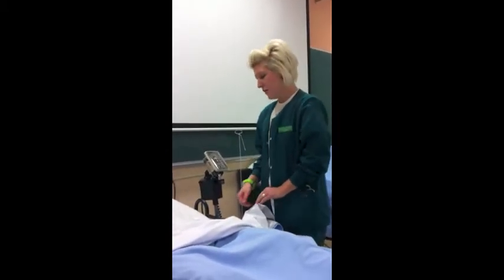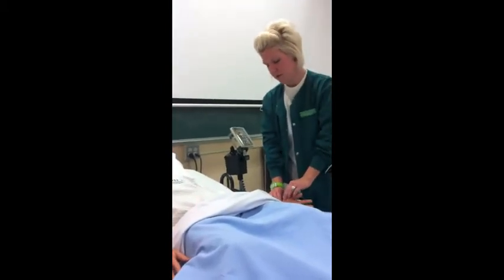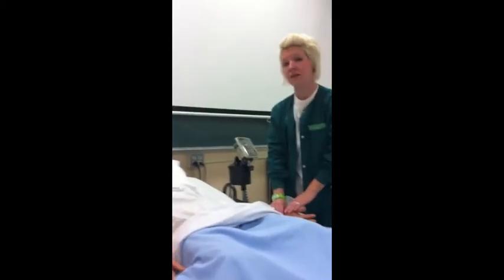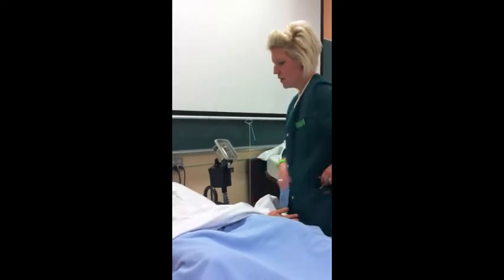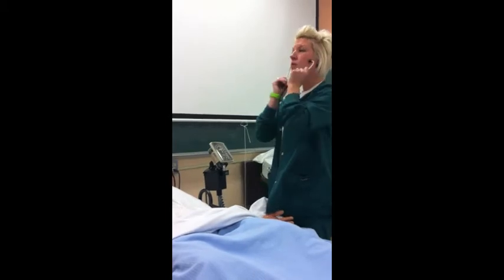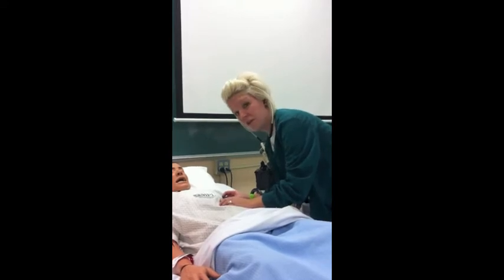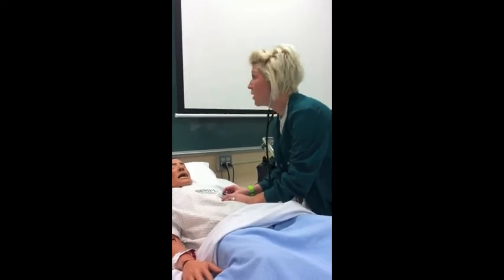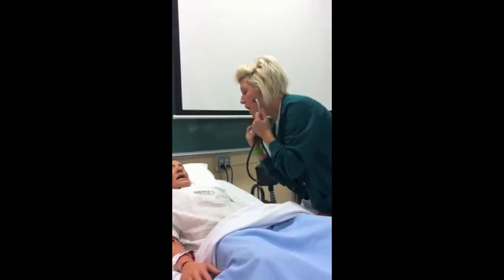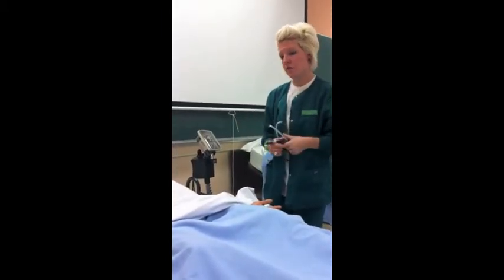So next I'm going to perform routine vital signs on my patient. I'm just going to let you know, Allison, I'm going to be taking your vitals. First I'm going to be taking her radial pulse for a full minute. Pulse rate is 78. I'm also going to take her apical pulse in the 5th intercostal space at the apex of the heart for a full minute. I'm also noting the patient's respirations, which are 18, which fall within normal range.